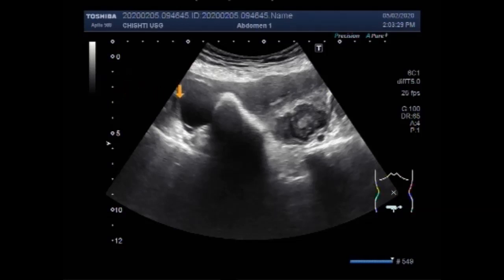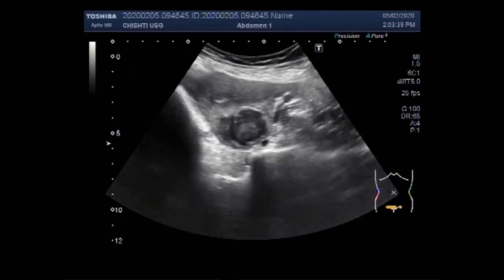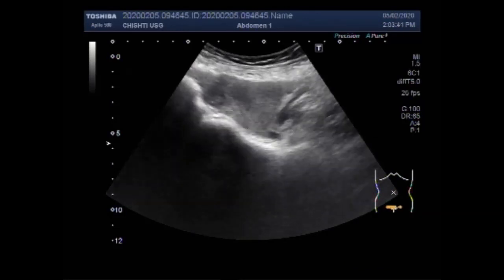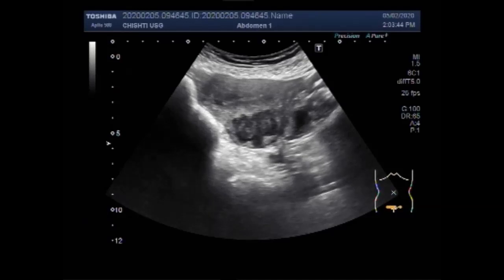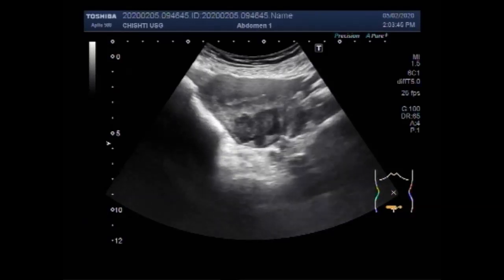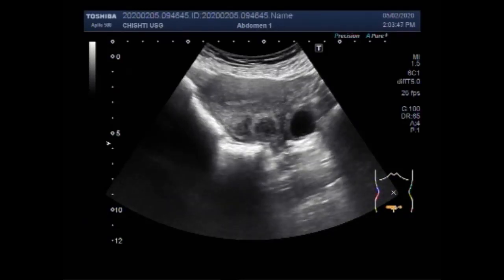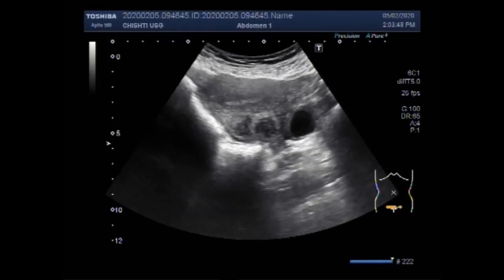This is the left ovarian cyst; this one is the mass. The right ovary also has a very small cyst — this one is the right ovarian cyst.